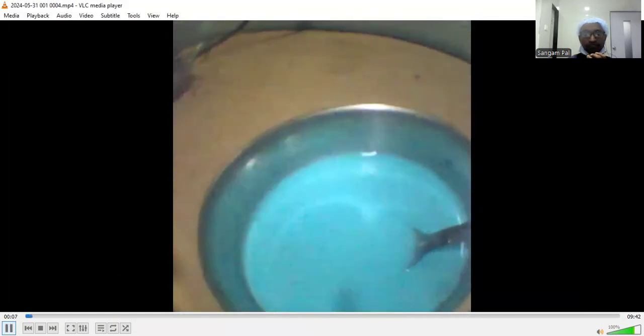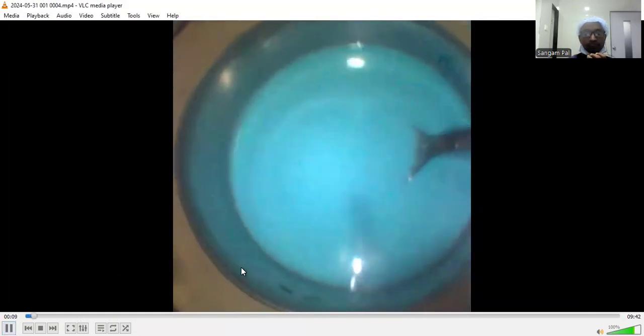Today, I'll be sharing a swallowing study of a patient. So, this is two types of food I have taken.